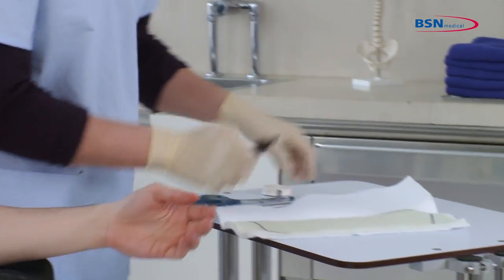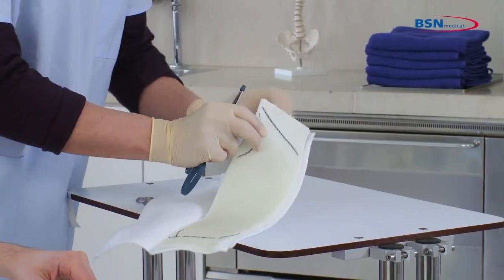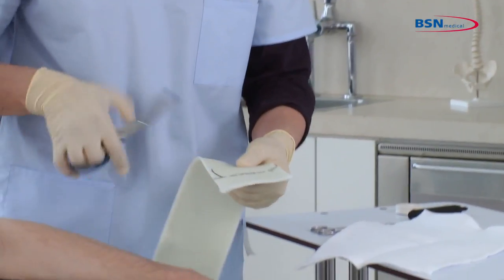Next, cut the marked parts. If the padding has been opened, it is optional to take the substrate out for this step. Then fold one side of the shape.